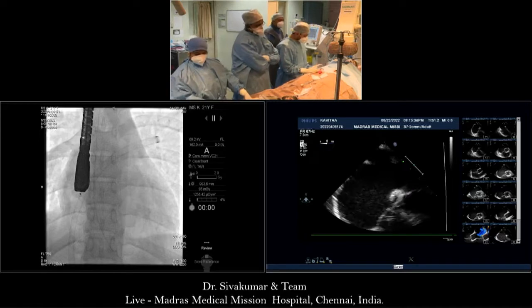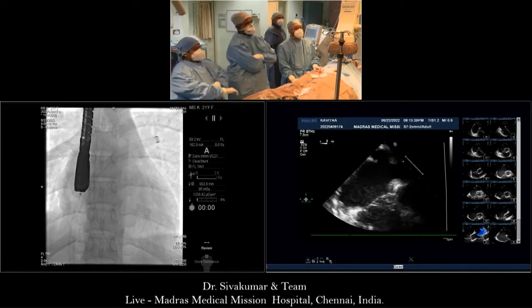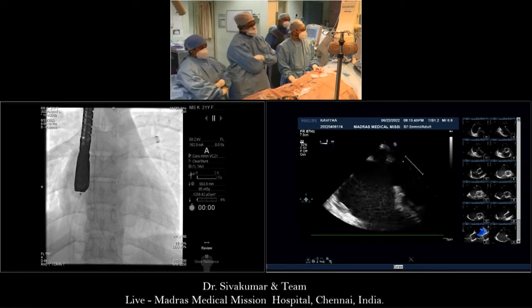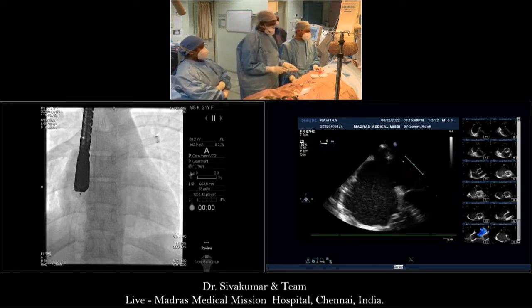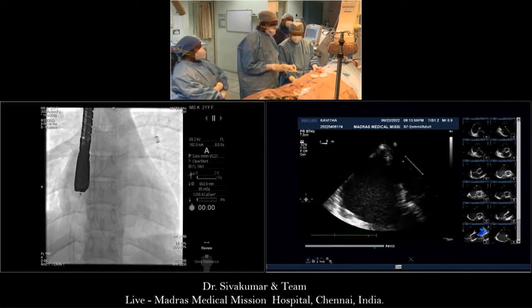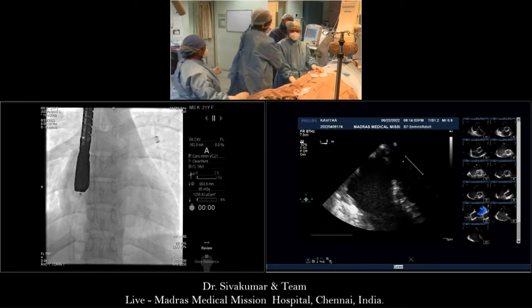So, a couple of things are very important. When you look at the aortic rim, if the aortic rim is absent, we must all remember that. Bald aorta is seen in multiple views, and that's the key. If you see aortic rim and you go from 20, 30, 40, 50, 60, 70 degrees, so you're seeing aorta in all these views, and you see aortic rim in any of these views, then it's not bald aorta. Bald aorta has to be in 3 consecutive views. You go to 30, 40, 50, you have bald aorta, then you have a high risk.